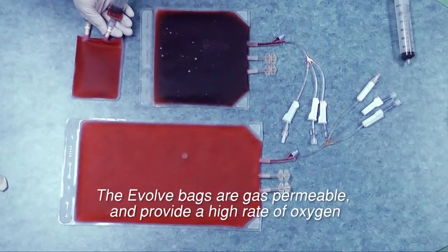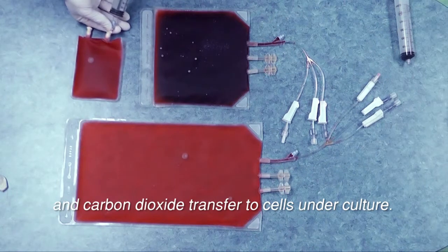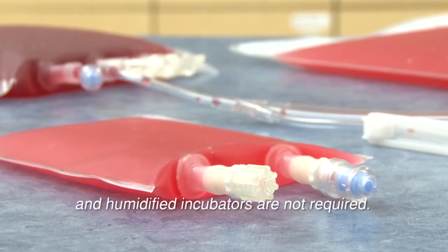The Evolve bags are gas permeable and provide a high rate of oxygen and carbon dioxide transfer to cells under culture. Water permeability is very low, so water loss is minimal and humidified incubators are not required.